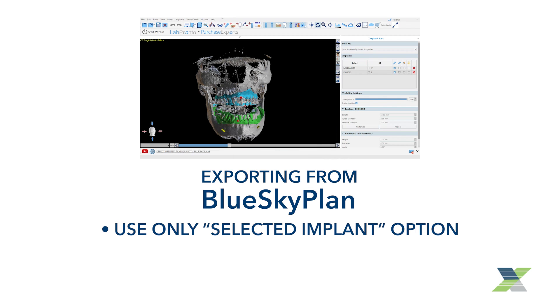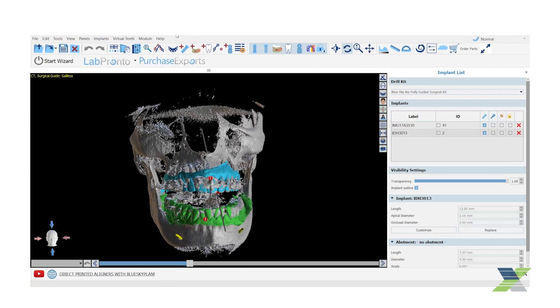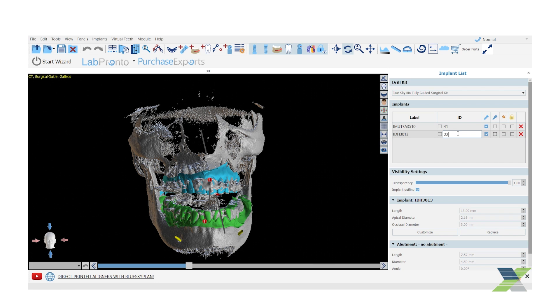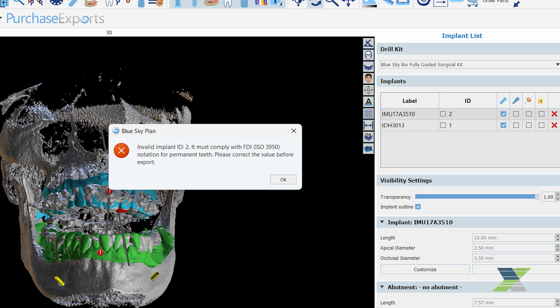Before you export the plan in the XGUIDE format, you must edit the implant ID number to the FDI tooth numbering system. To edit this, click inside the ID box and type in the appropriate number. If the ID number is not edited to the FDI tooth numbering system, a warning message will appear displaying an invalid implant ID.